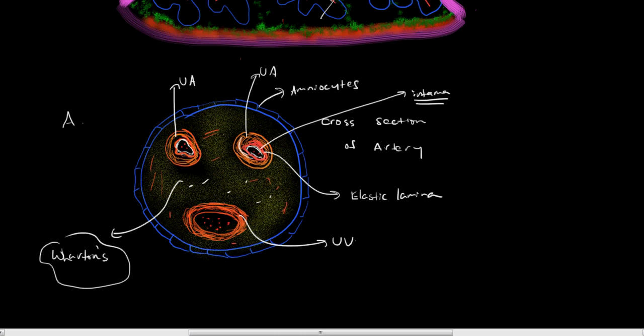The other thing I'd call your attention to is that sometimes we see developmental remnants within the umbilical cord. One of the remnants that we see, which always exists between the two arteries, is a urachal remnant. The reason the urachal remnant is between the two arteries is, if you think about the fetal side of the equation, here's the fetal bladder, and the bladder tapers up and runs into the umbilical cord in the portion called the urachus. And what runs right beside the urachus? The two umbilical arteries.